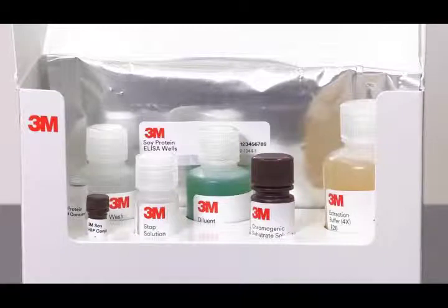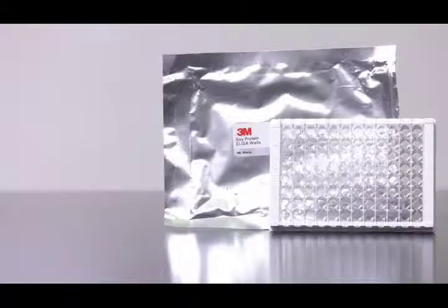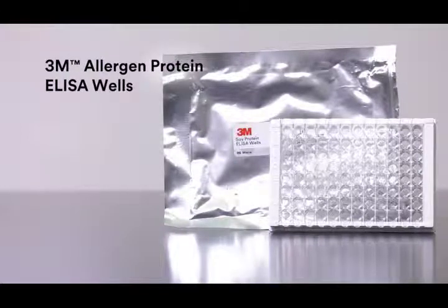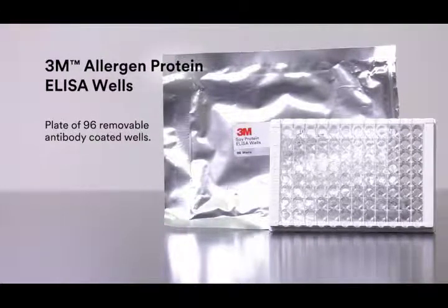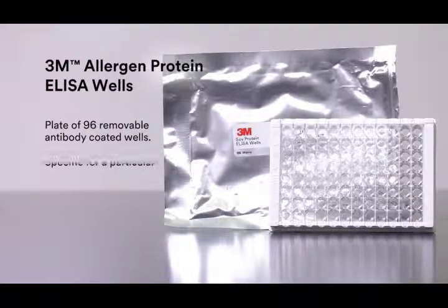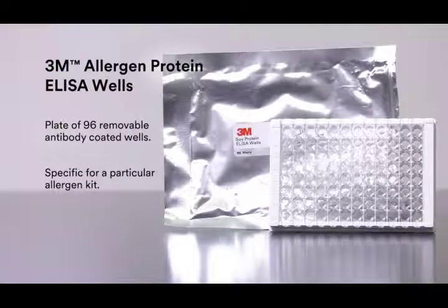The 3M Allergen Protein ELISA kit contains the following components. One 3M Allergen Protein ELISA wells. The foil bag contains a plate of 96 removable antibody coated wells that are specific for a particular allergen kit.